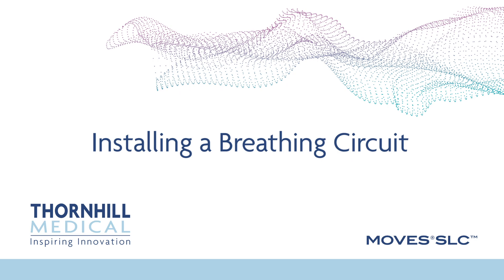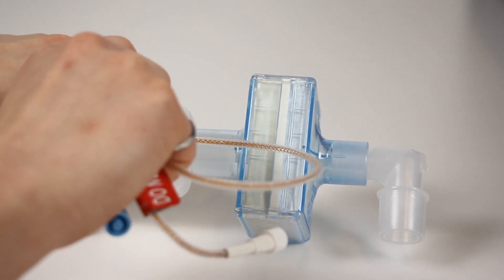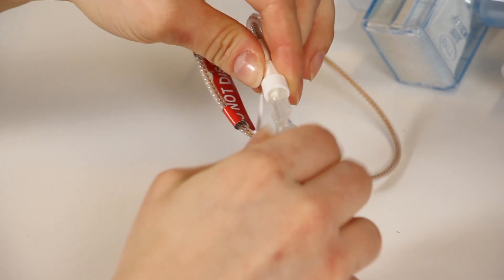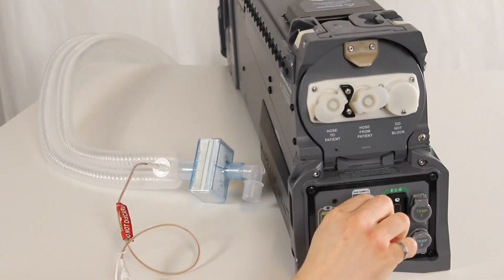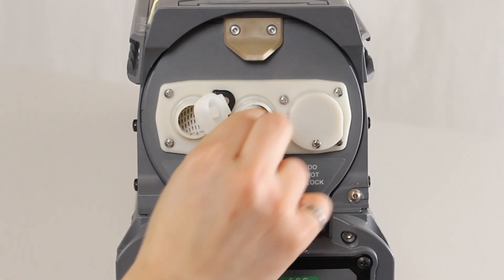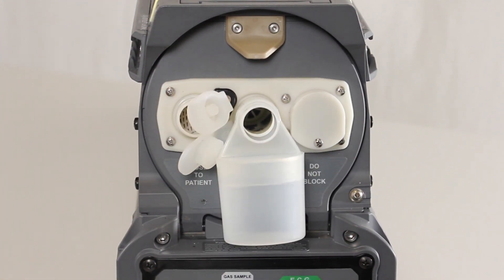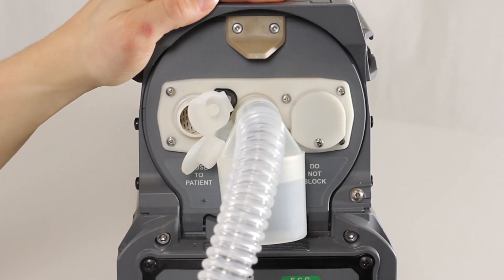Installing a breathing circuit. Ensure that the ventilator cartridge is inserted into the MOVES SLC. Connect one end of a Nafion tube to a sample filter on the Y-piece. Use the butterfly lure connector to connect the Nafion tube to the sampling line. Attach the other end of the sampling line with a sample filter to the gas sample port on the MOVES SLC patient connections panel. Unplug the hose covers on the hose-to-patient and hose-from-patient ports and attach the water trap to the from-patient port. Attach the ventilator breathing circuit patient hoses to the water trap and the two-patient port on the ventilator cartridge door.